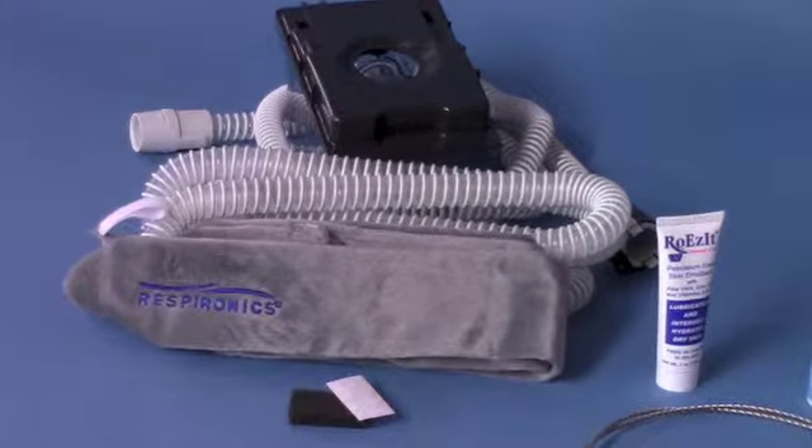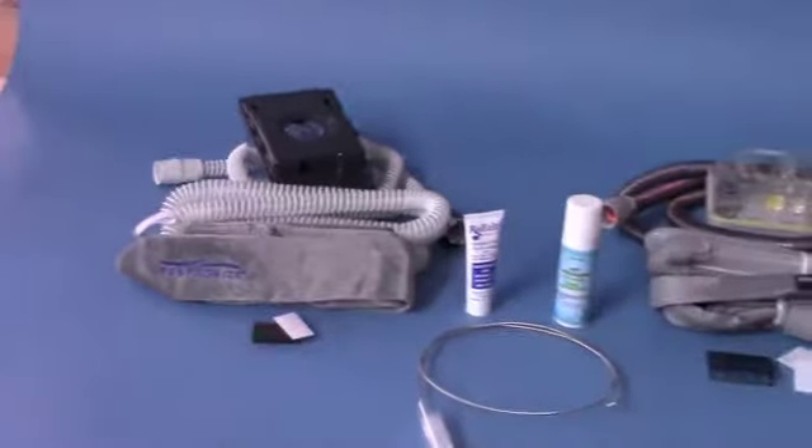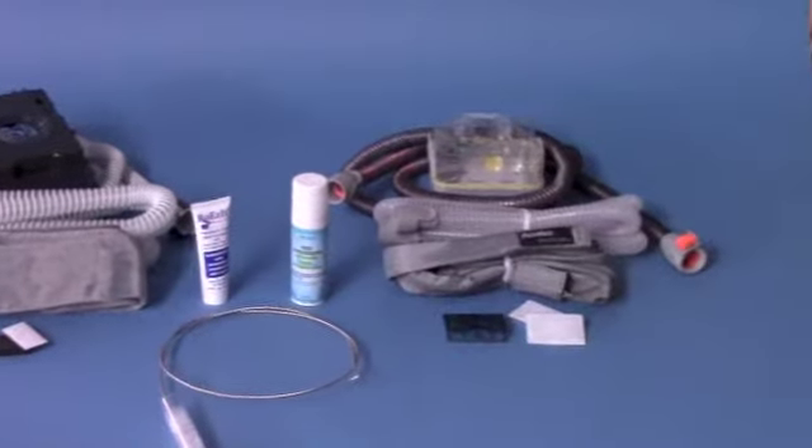In this video, we will discuss the different kits and tiers available for the Respironic System 1 60 Series and the ResMed S9 Series CPAP machines.